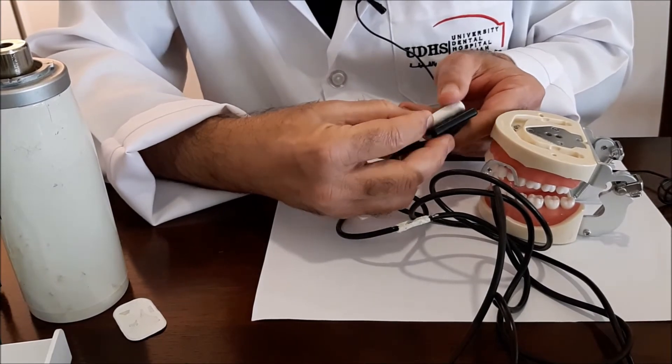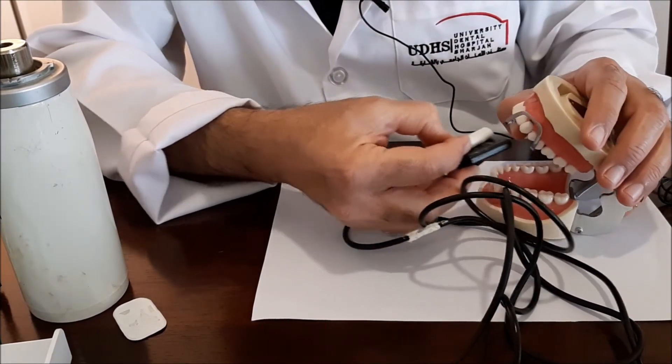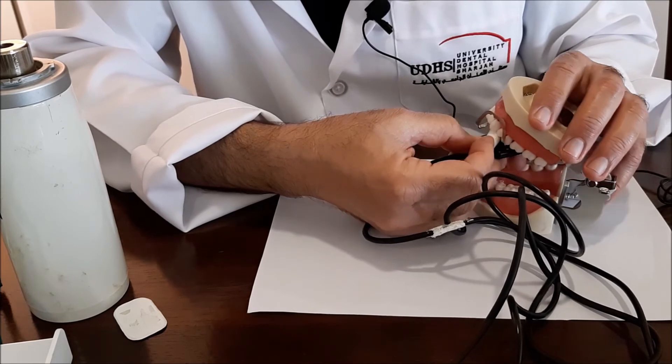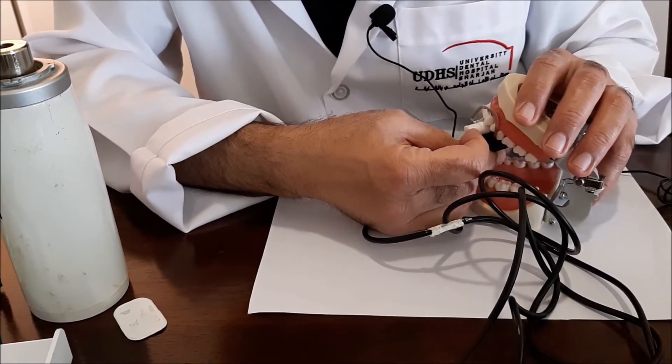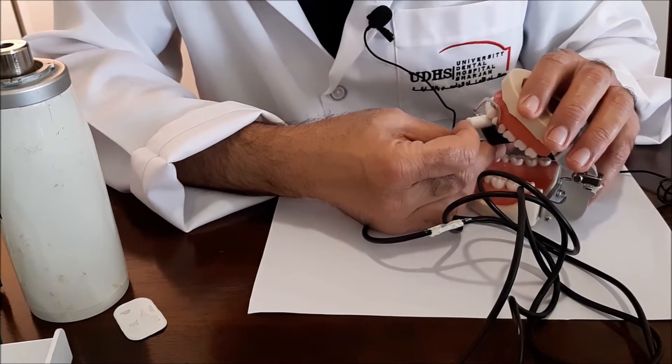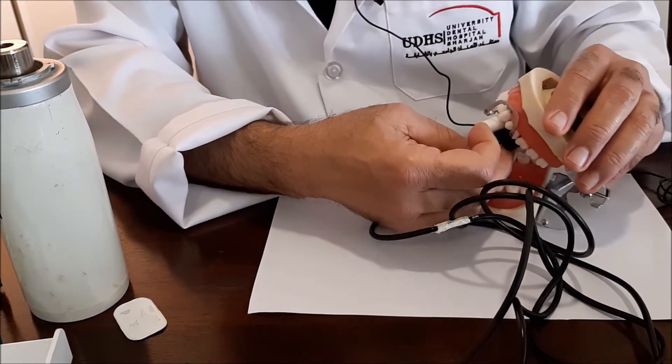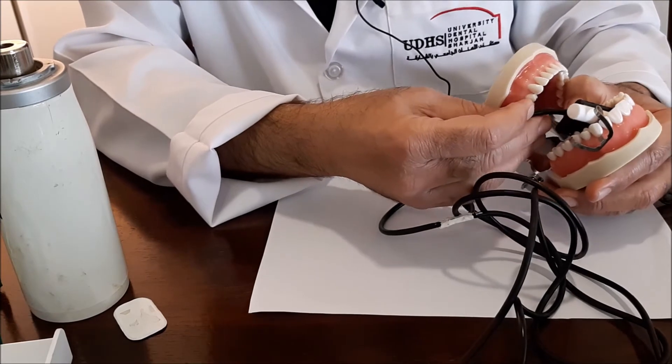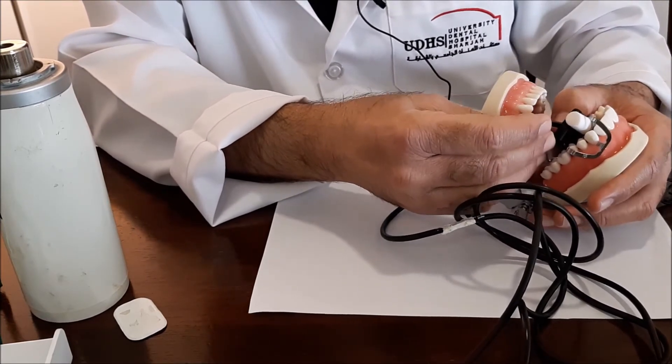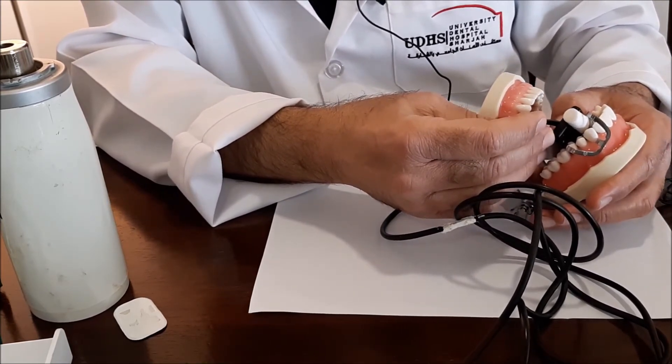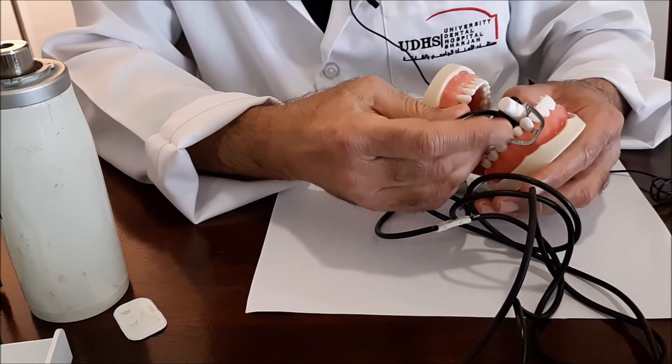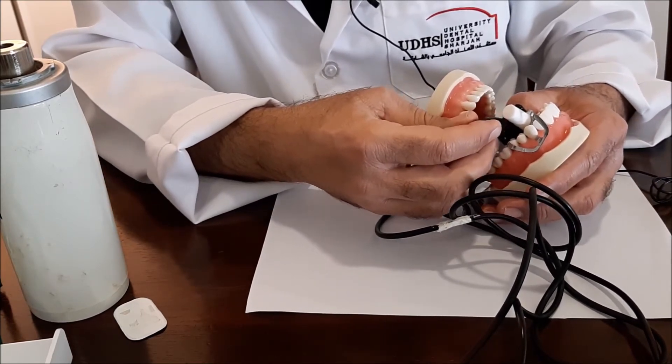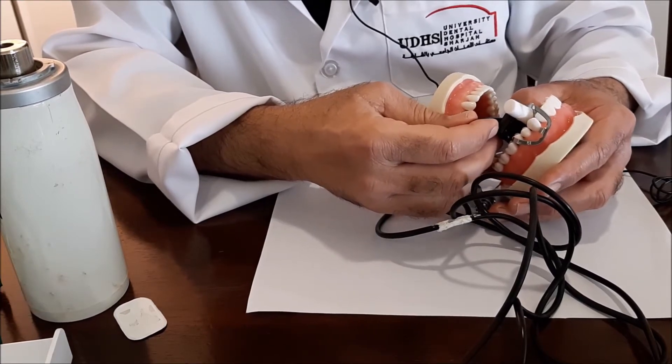You place your cotton roll, and then you tilt the sensor so that the longest dimension of the sensor will be located behind the canine. And this is how it looks from the back. See, by so doing you have utilized your longest length or the longest dimension of the sensor.